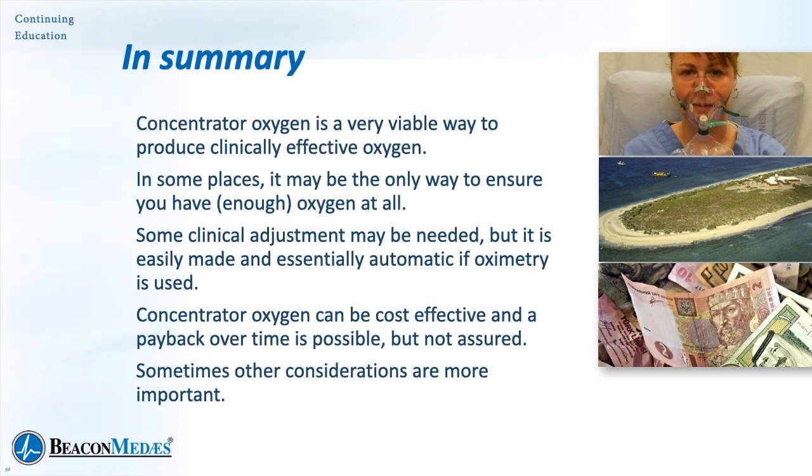The question of whether concentrator oxygen is cost effective is a difficult one to answer, because it varies so much with the transportation, the cost of your oxygen, cost of your electricity. It's hard to say if you'll actually get payback from a concentrator. Obviously that can be evaluated, but for the most part it's best not to assume that you will get payback. It needs to be validated. But sometimes other considerations are just more important, and this may be one of those times where that's true.